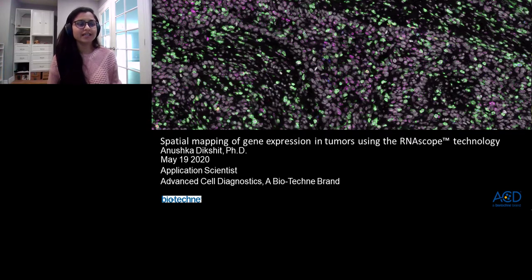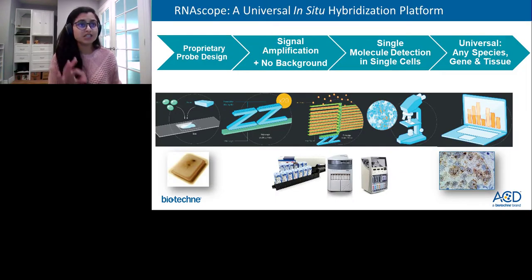Thank you for being here today. Today I'll be talking to you about the RNAscope technology, which is a gene expression technology that allows you to visualize your targets with spatial and morphological resolution. For those of you who are not familiar with the RNAscope technology, it is an in situ hybridization platform that was specially designed to overcome some of the traditional limitations of the ISH assay while still maintaining high sensitivity and specificity of detection.